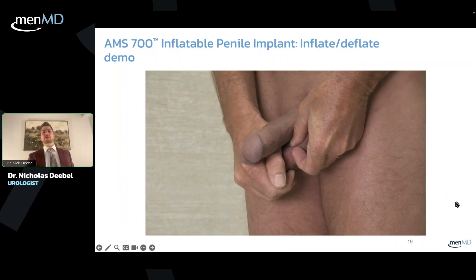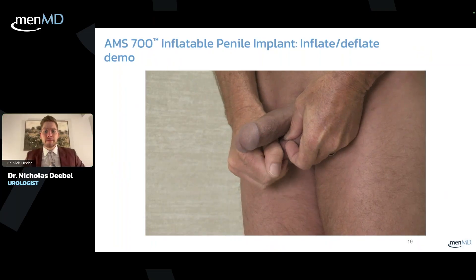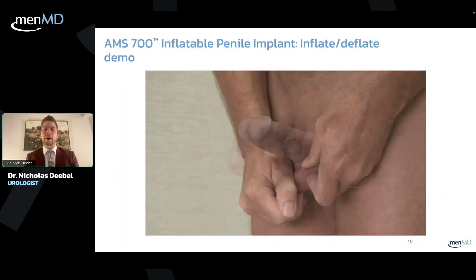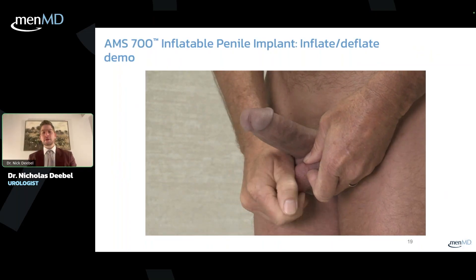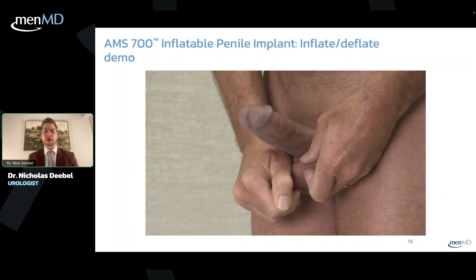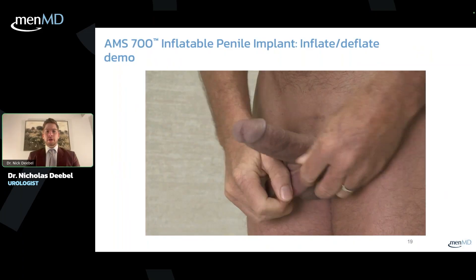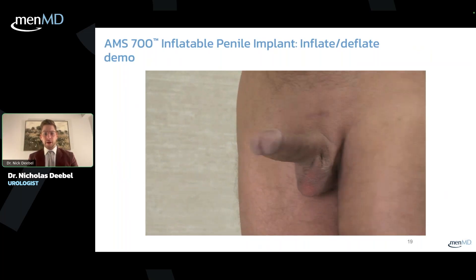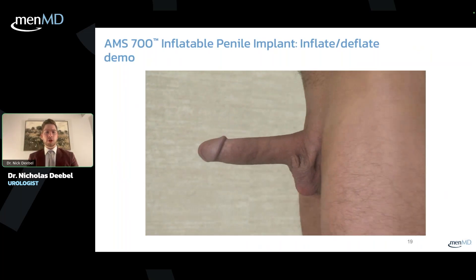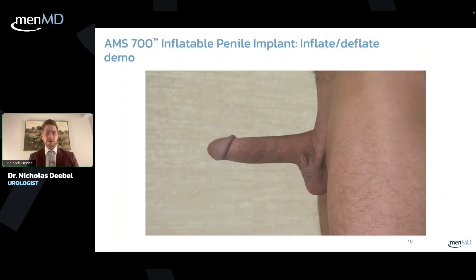You can see the patient squeezing the pump and he's inflating the device right now. You can see as he pumps it — pretty easy to pump, not hard to use. And as you can see, that's a very rigid erection, very functional, looks and feels like a natural erection.